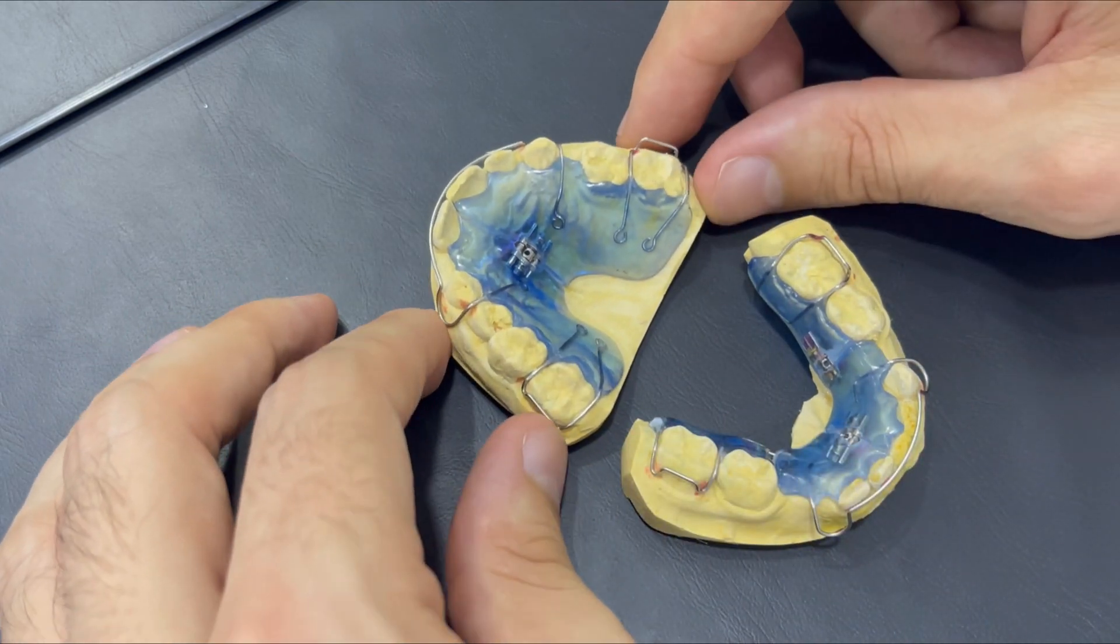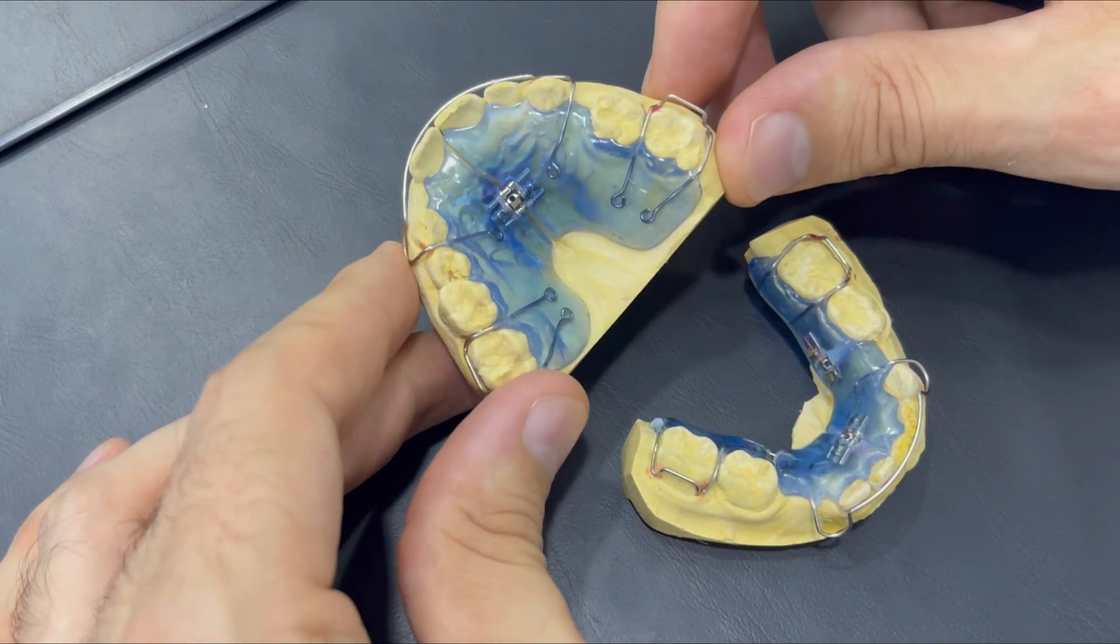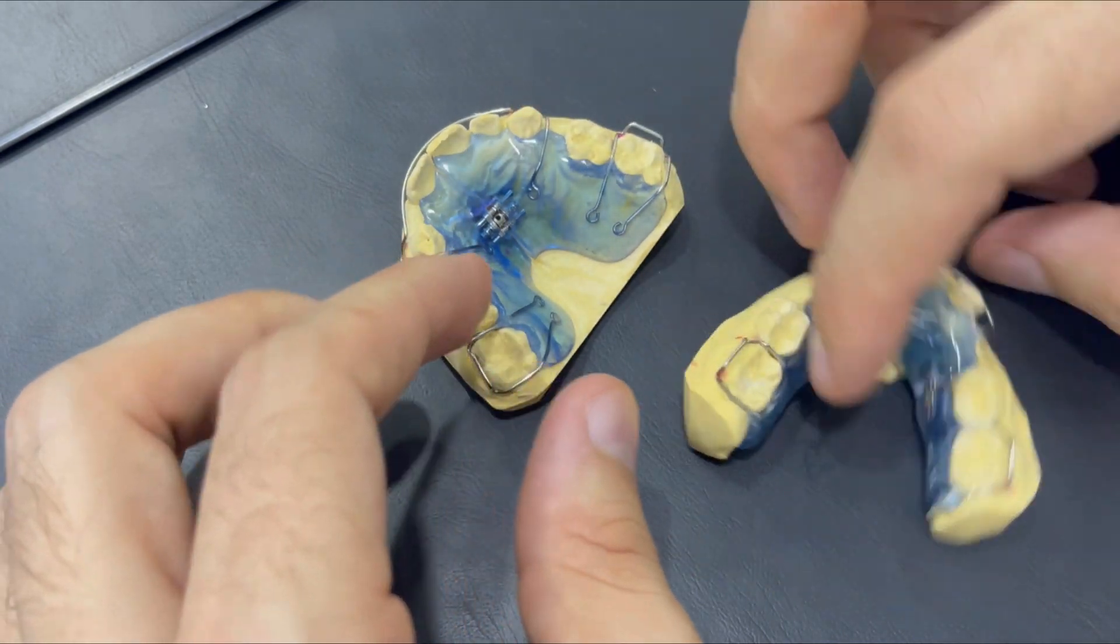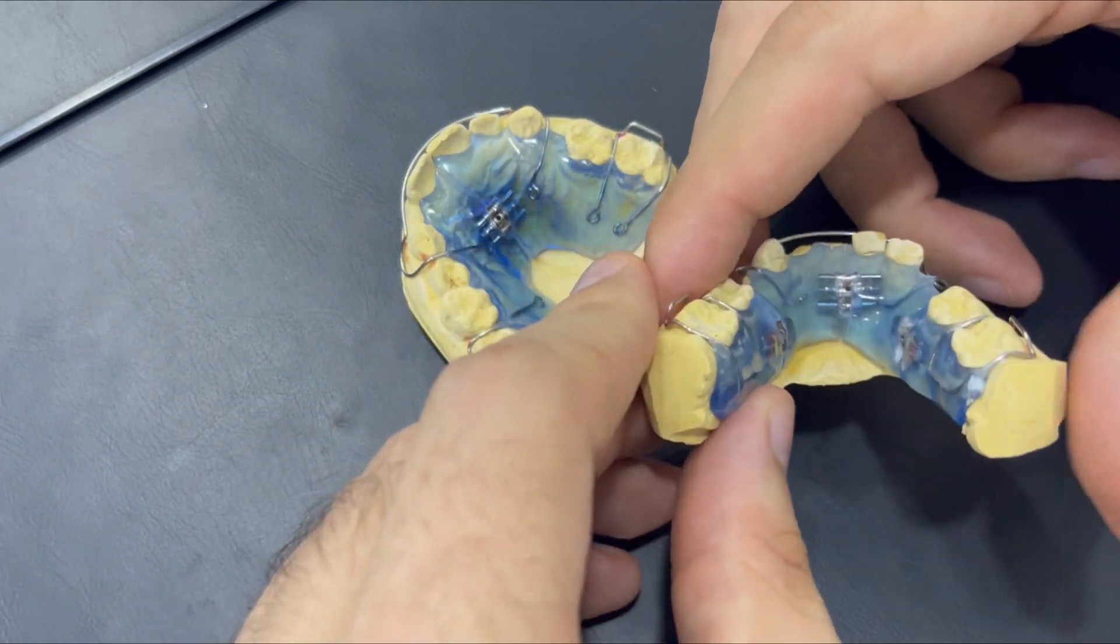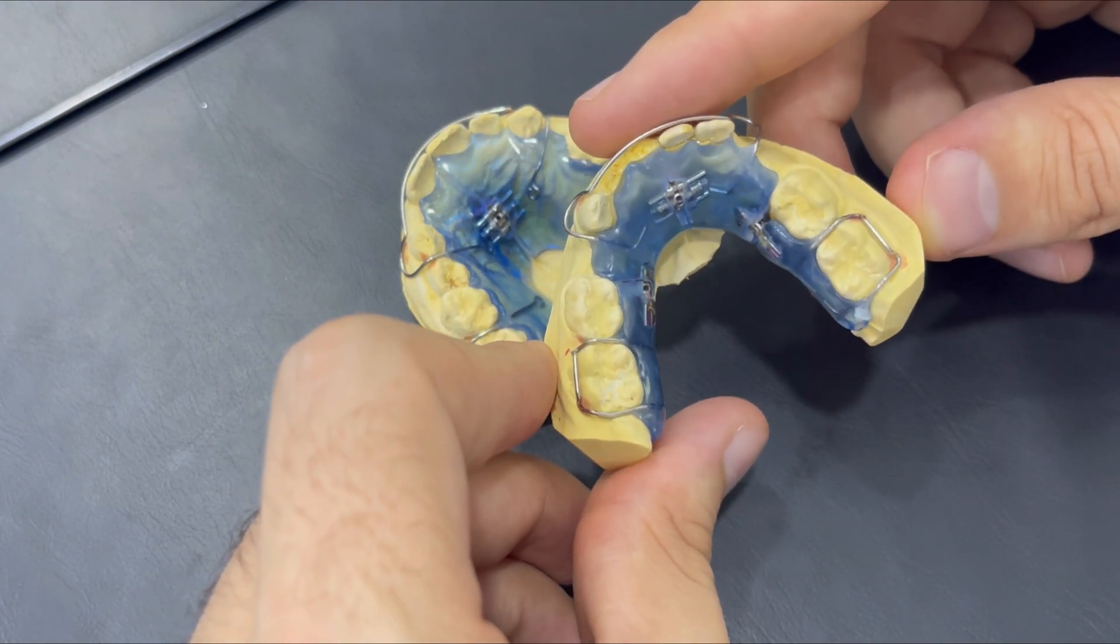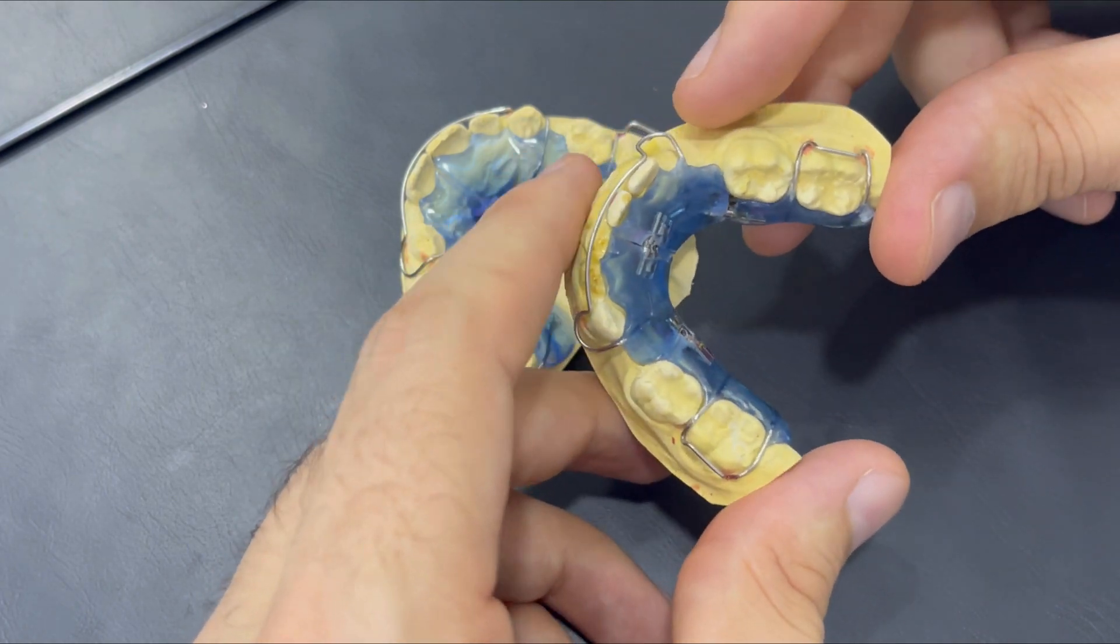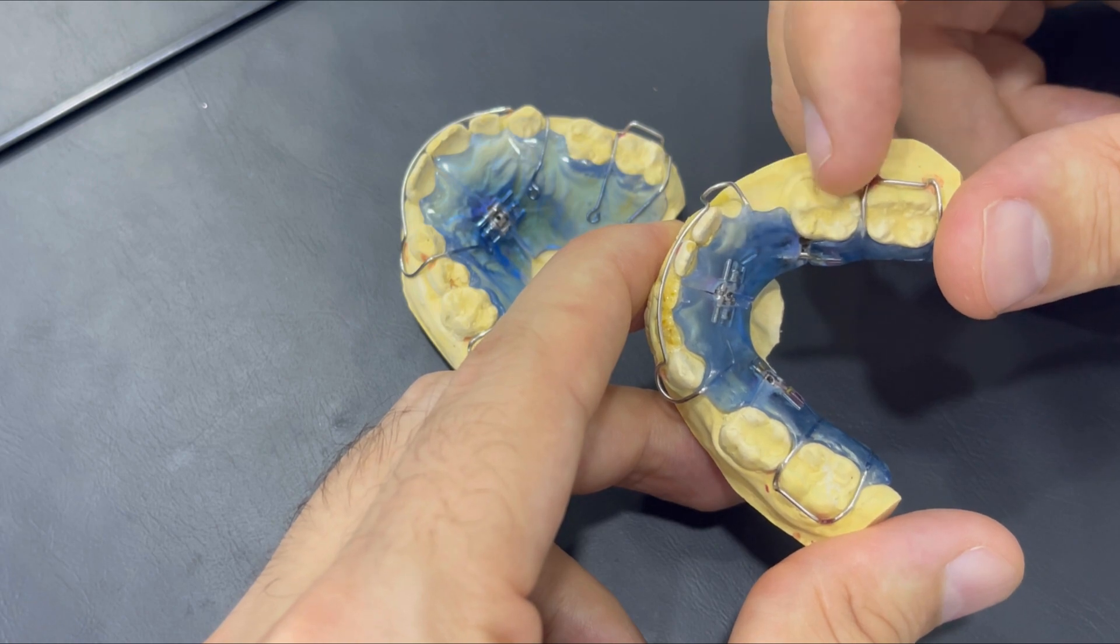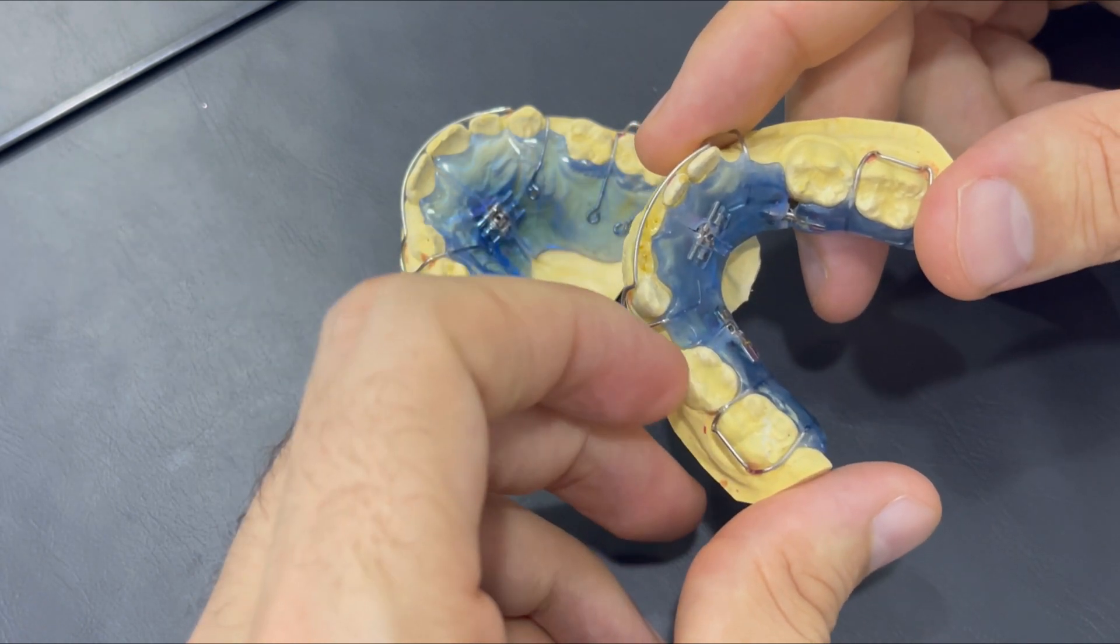In this Howley removable expander, we can see the Howley screw expander in the middle in the upper appliance, and the lower is 3D expansion actually. As you see, there's three screws: one for horizontal expansion and the other one for the sagittal.